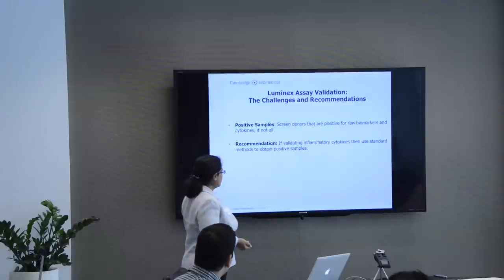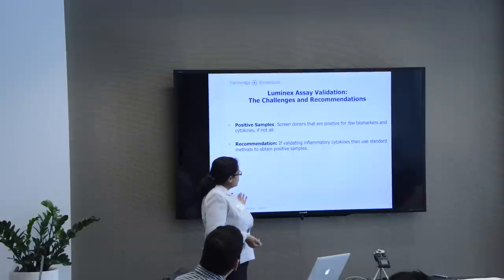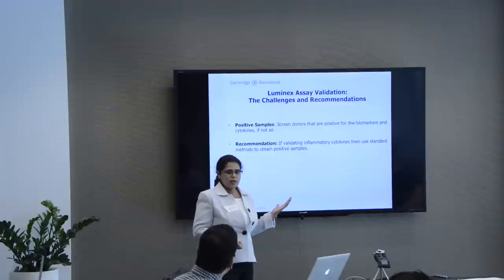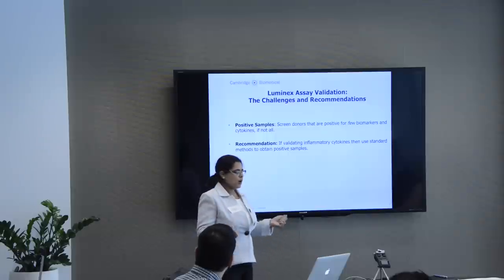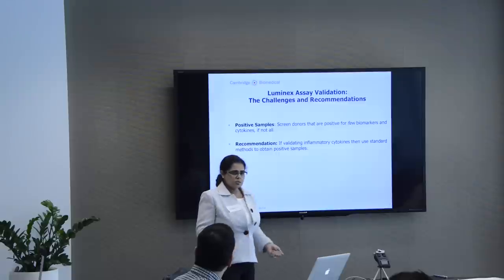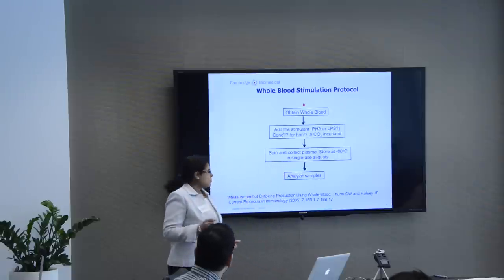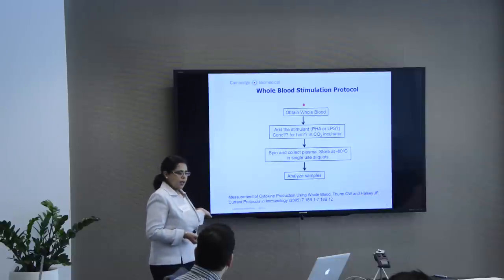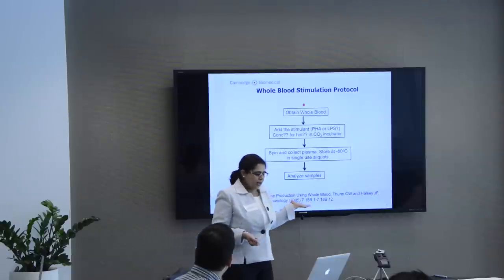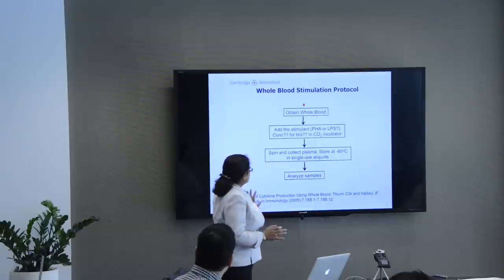So this is what we recommend, and this is what we often do. If you are validating inflammatory cytokines, there are published methods. If there is a published method that can give you a positive sample, go ahead and use it. One of the common methods that we use is from Current Protocols in Immunology, and the title is whole blood stimulation. Okay? So this is how it's done.